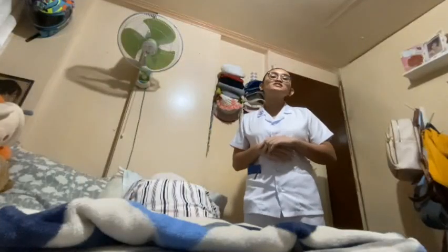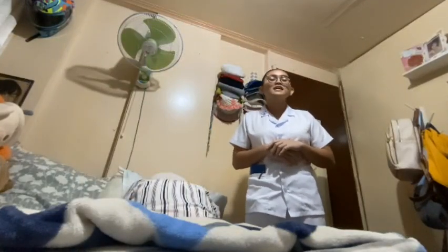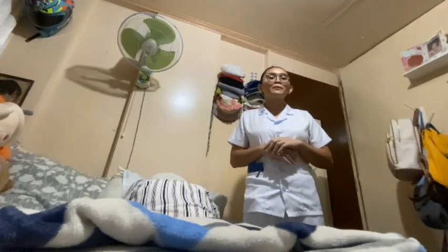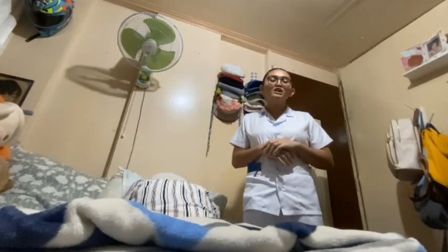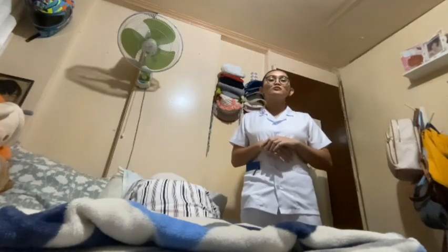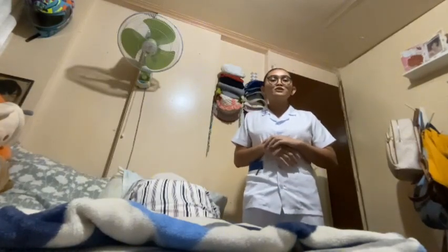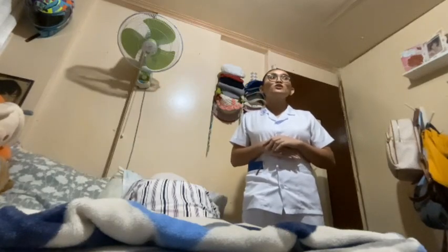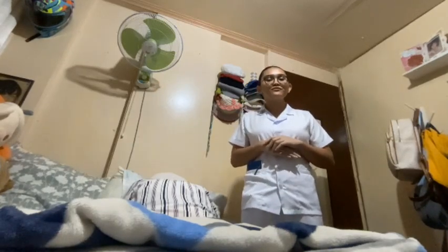Good day, I am Daniela Villancero-Manilios, and today I'll be demonstrating urinary catheterization. This procedure is done to drain urine from the bladder when a patient cannot urinate on their own, to relieve bladder distension, to collect a sterile urine sample, or to closely monitor urine output. It is also commonly used after surgery for comfort and accurate measurement. The goal of catheterization is to promote patient safety, comfort, and proper management of their condition.